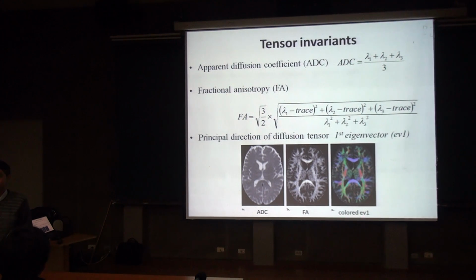But in the gray matter, because they are all cells, cells are large and the water can go inside and outside of the cells. So water molecules have more free diffusion in the gray matter. And because of higher restriction in the white matter, the white matter actually shows higher FA because there is a directional dependence of the diffusion in the white matter, because they are all axons.